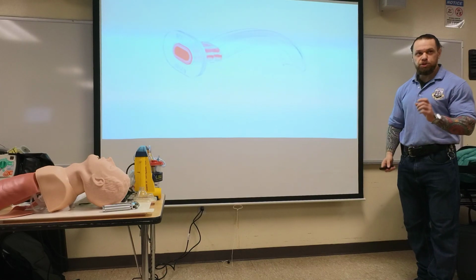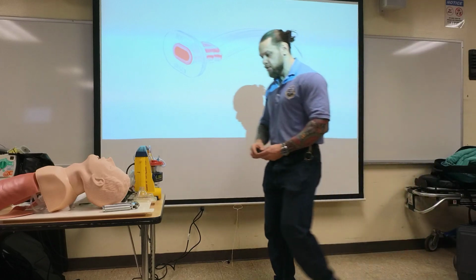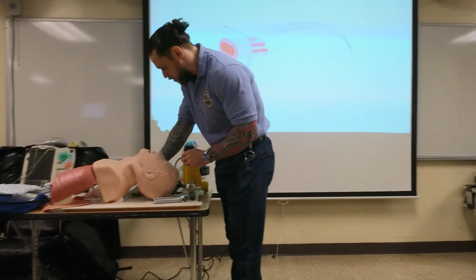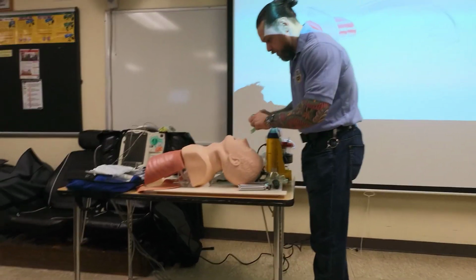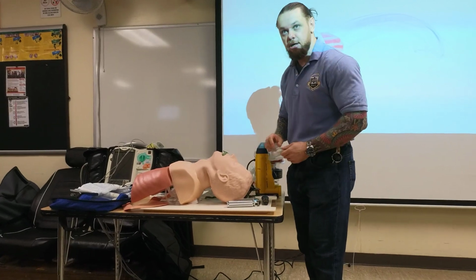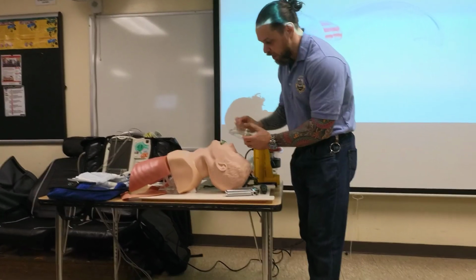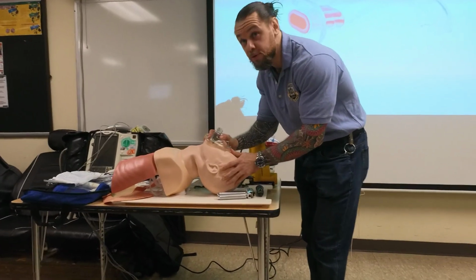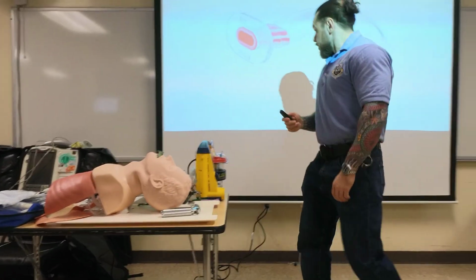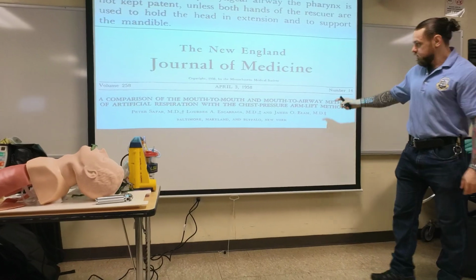By the way, the purpose of the OPA is to not allow the operator from closing the mouth. So let's say I had my OPA in place. The purpose of the OPA is not to lift the tongue out of the airway. It's not to allow you to do this, so you cannot close the teeth. So this is another study again.